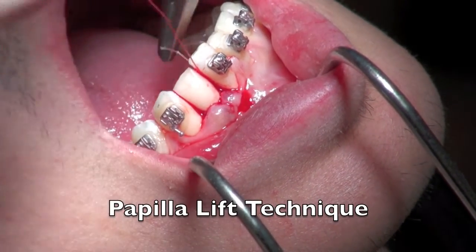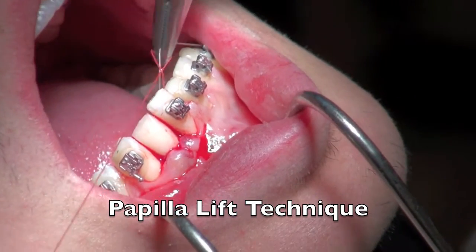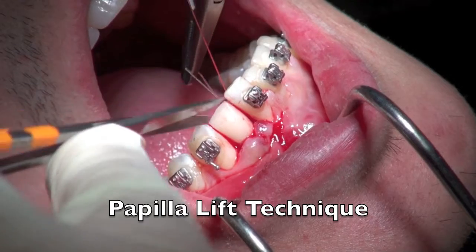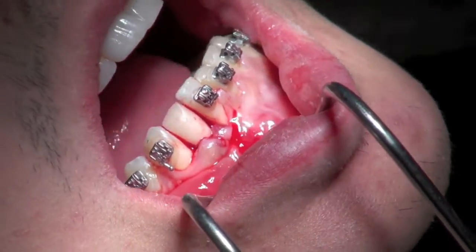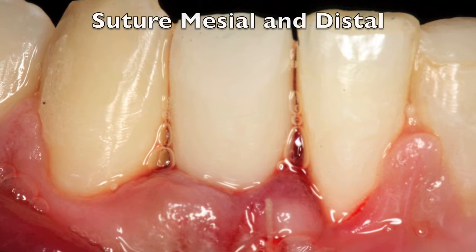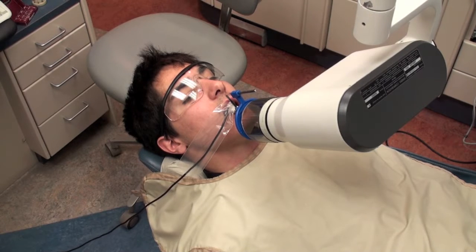As I tie off this gut suture — I would use silk sometimes, but gut is good since this patient comes from about two hours away — we want to make sure this is going to be able to be absorbed. You can see the suture in position lifting up the papilla and creating a nice look for the patient.